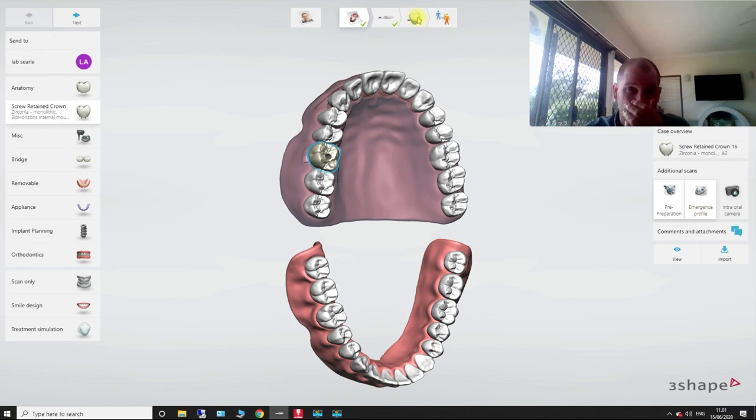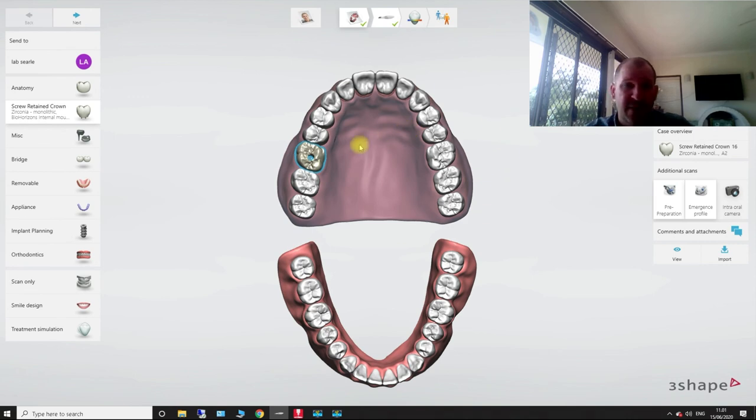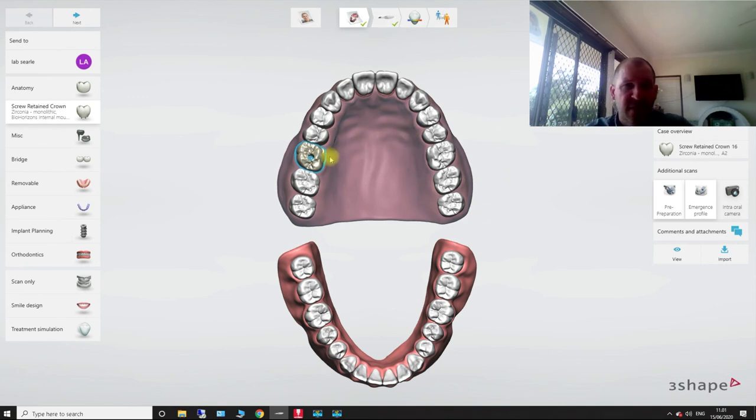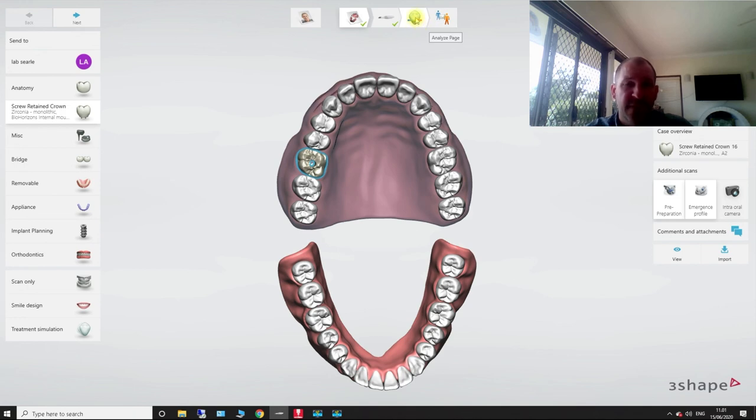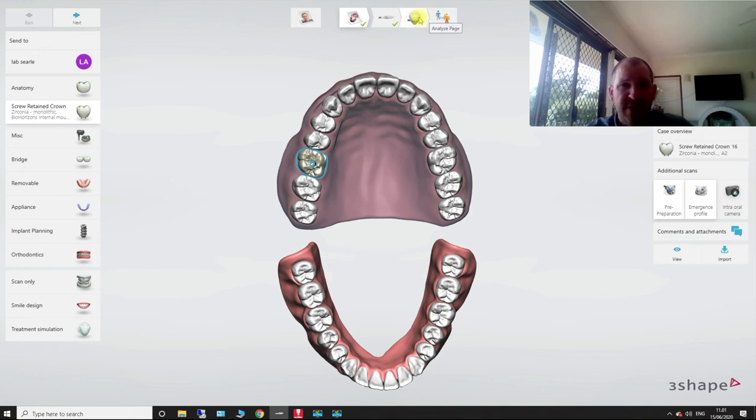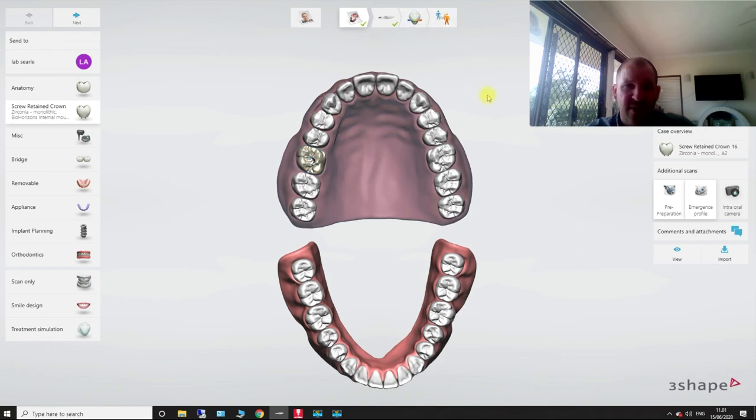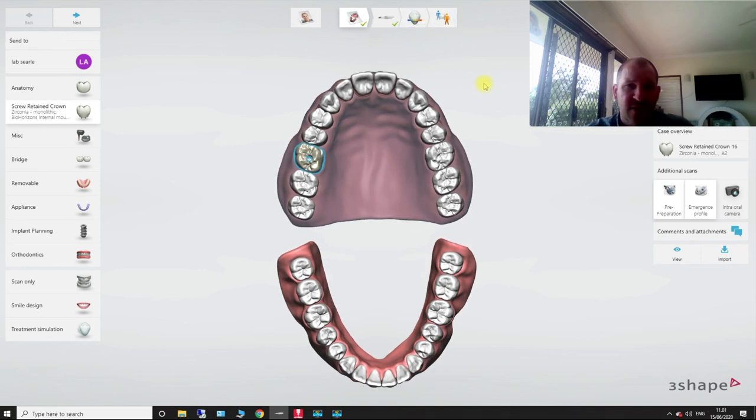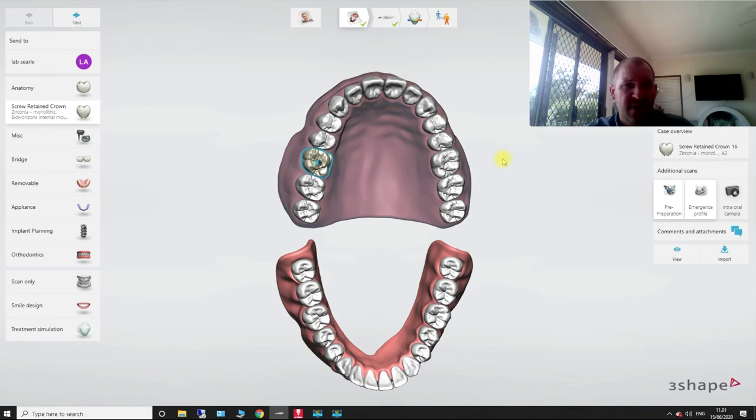lock the emergence profile after you've done the healing cap scan. So that way that if any blood comes on there, or if you have any sort of a collapse of tissue, it's going to lock it into place. And then pretty much, for those guys that are sending off to the lab, obviously you just hit send. For the ones that are doing it in-house, then you're going to then obviously start to design it in-house. So all good, all the best guys, and I'll speak to you later. Bye.